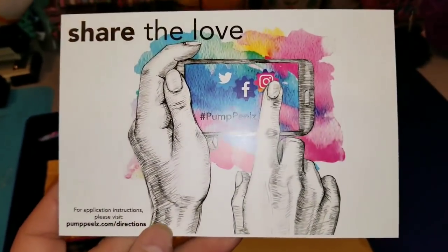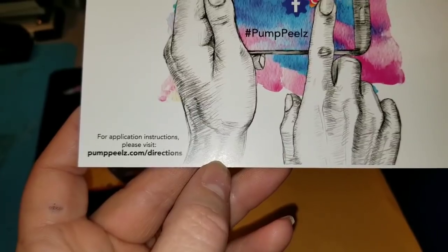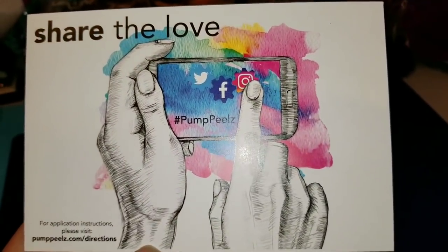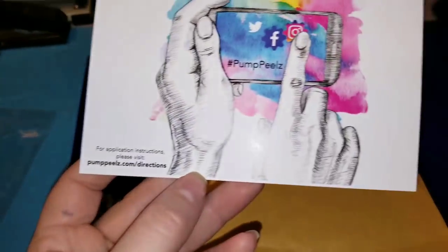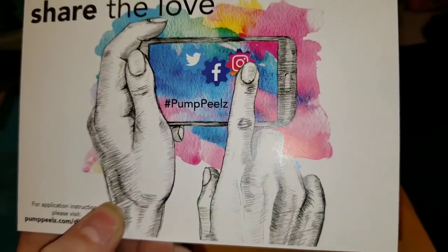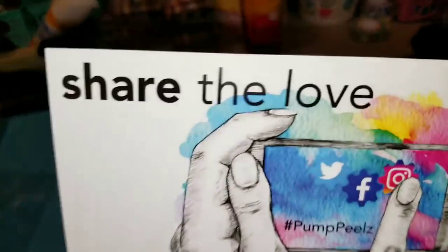They also give you this really awesome card with their Pump Peels 'Decorating Diabetes' logo. On the back it says 'Share in the Love,' and shows that for application instructions please visit pumppeels.com/directions. They love when you share your reviews or pictures of you decorating your diabetes. Hashtag Pump Peels on Instagram, Twitter, and Facebook — they love seeing you share the love.